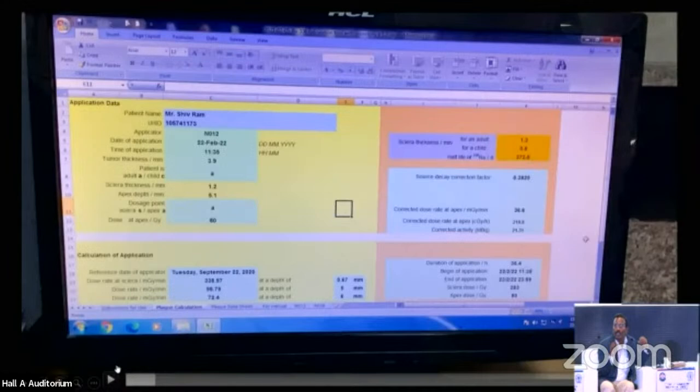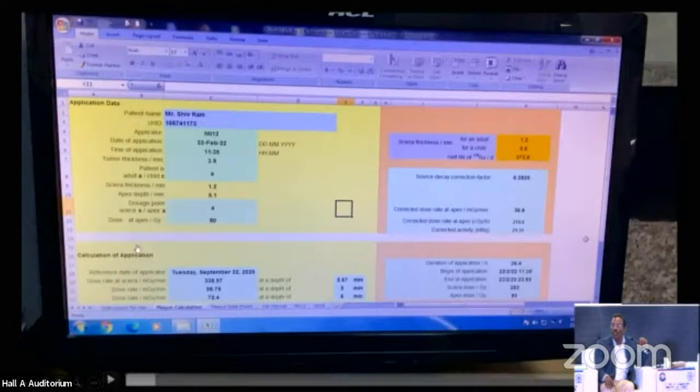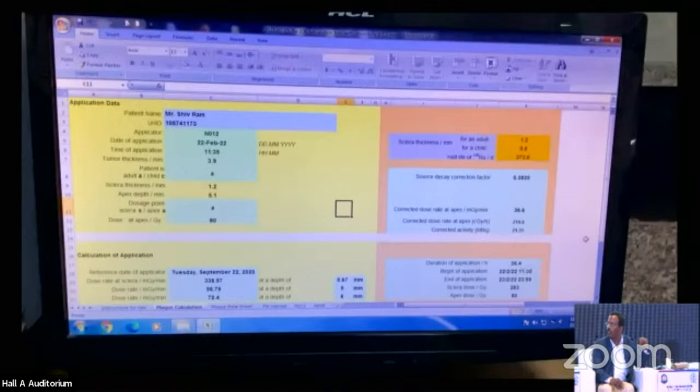There are many ways, like manual calculation. There are other ways also, using imaging and simulation. This is how we determine how much time the patient needs, based on the prescription dose. This is a simple process, one that we adopted initially. Now we are planning the next advanced stage of treatment planning, using simulation based on imaging. So this is briefly what it involves.